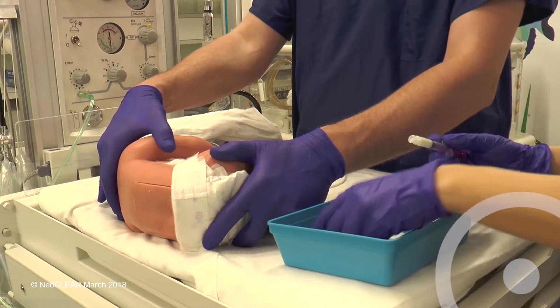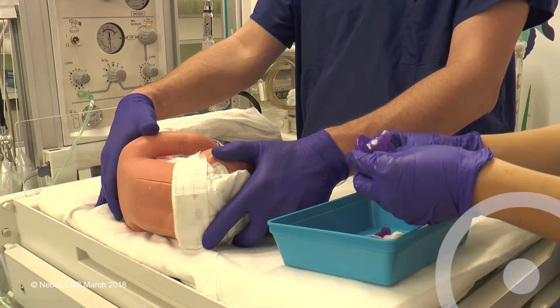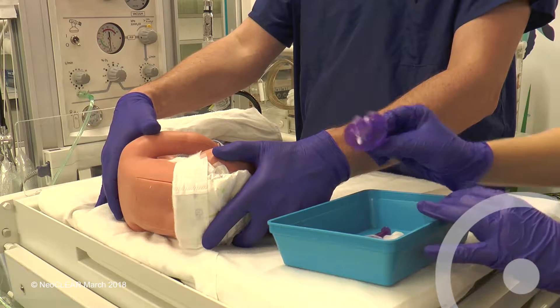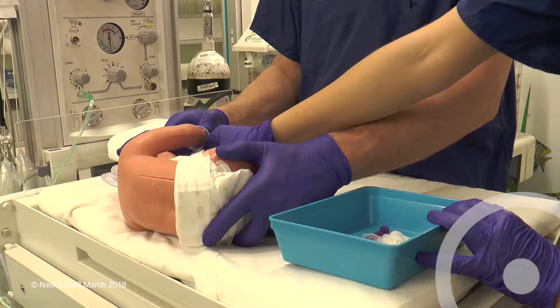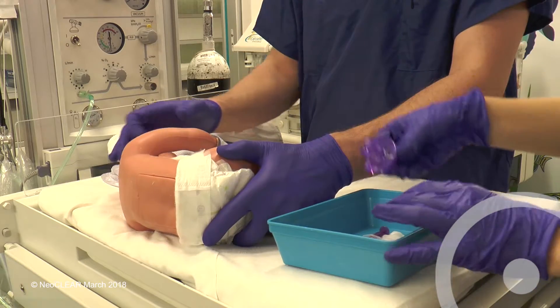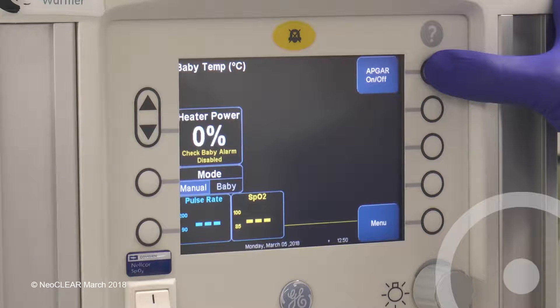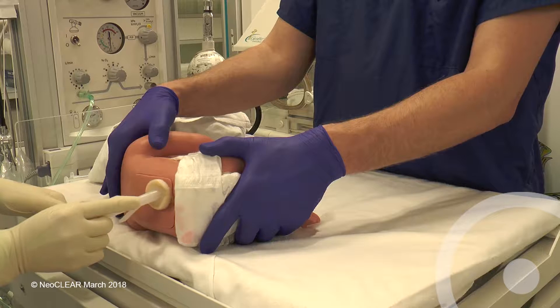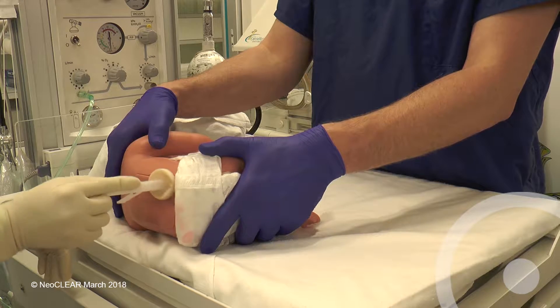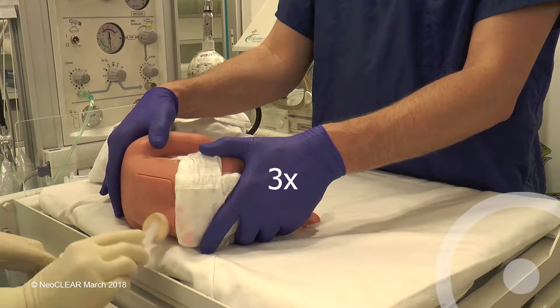The first assistant can relax their hold while the operator rewashes their hands and puts on the gown and sterile gloves. The infant may be given a few drops of milk or sucrose solution before the procedure and again during the LP if needed. The second assistant should begin timing at the start of cleaning the skin. Clean in a spiral from the lumbar region out to the iliac crests. This should be done three times and allowed to dry for 30 seconds.